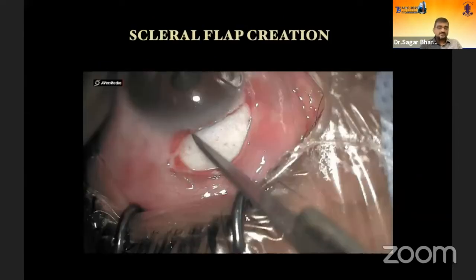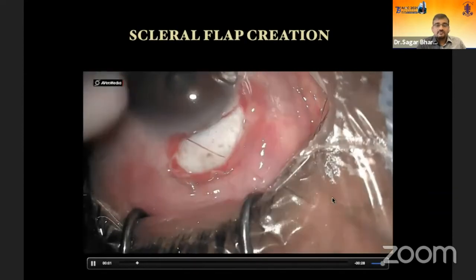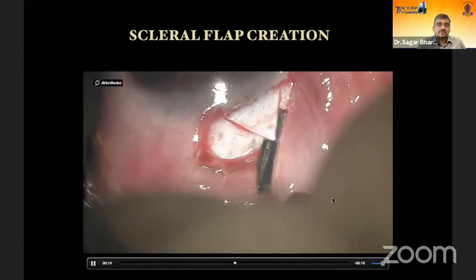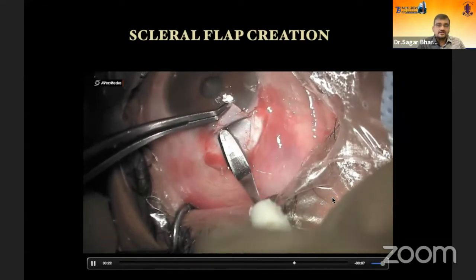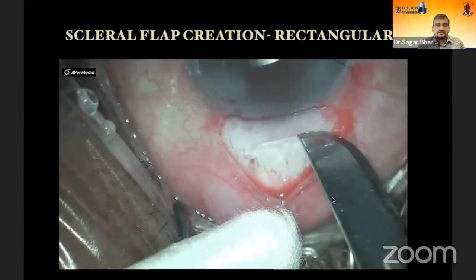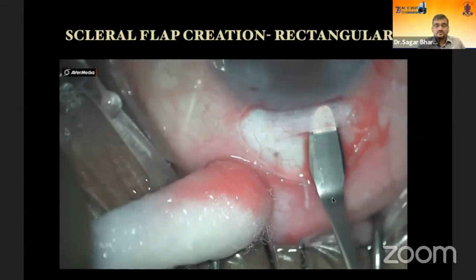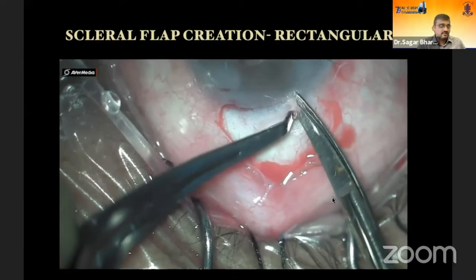For scleral flap creation, there are different approaches. A triangular flap can be created using an 11-blade and then a crescent to create a plane. The flap thickness is important — not too thin, which risks flap tear, and not too thick, which risks premature entry. As you lift the flap, you can see clear cornea and dissect up to the clear corneal space. Alternatively, a rectangular flap involves creating an approximately 4-millimeter tunnel about 3 millimeters from the limbus, then cutting the sides with scissors. A crescent makes a very smooth interface.